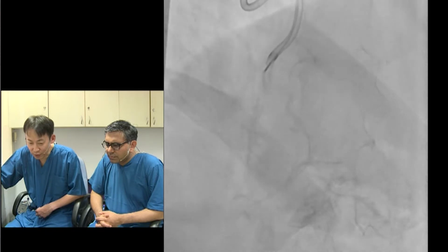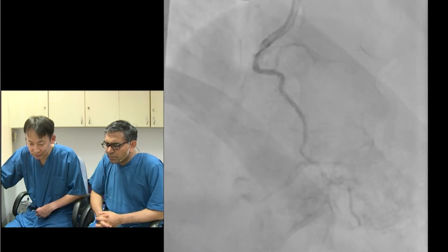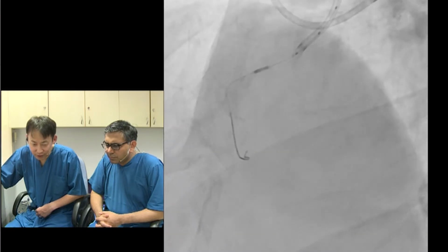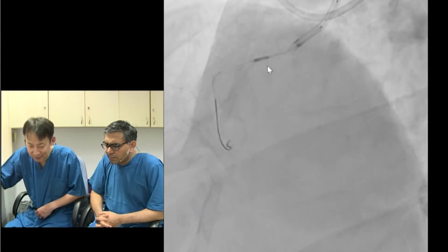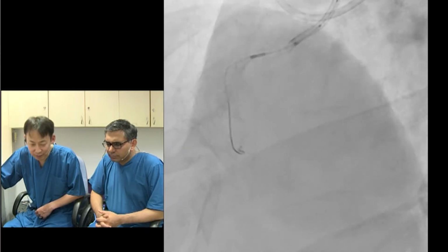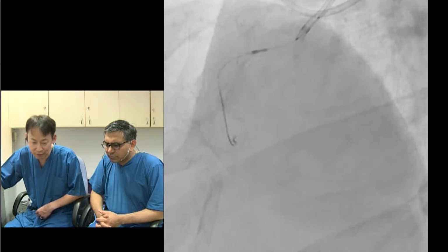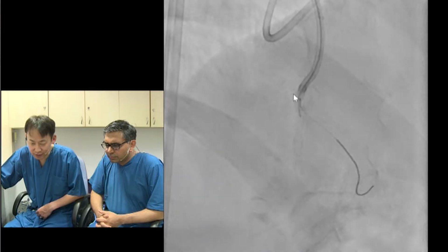Can I go ahead? Yeah, please. Of course, I wanted to see the orifice by IVUS, but this is Volcano. I could not go to the proximal bifurcation because of the calcification. So I gave up the IVUS examination to identify the proximal cap of the CTO. So I used the dual lumen catheter Sasuke.